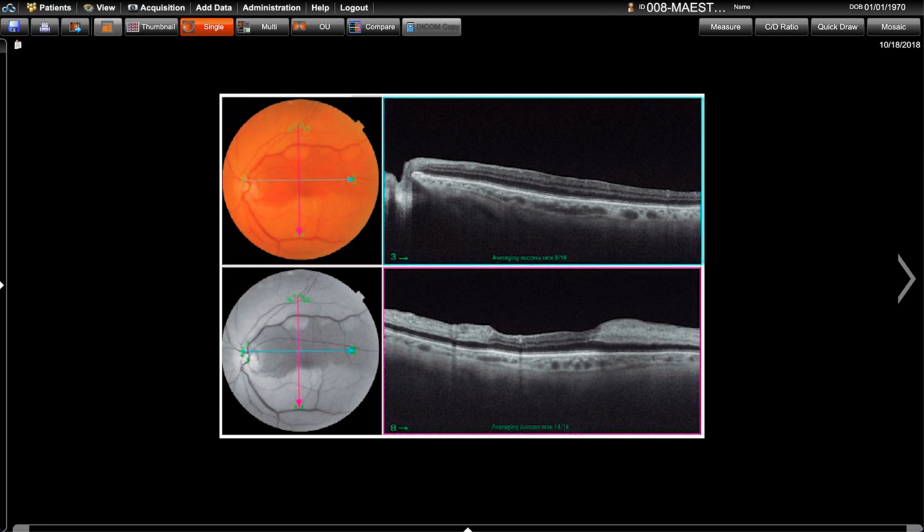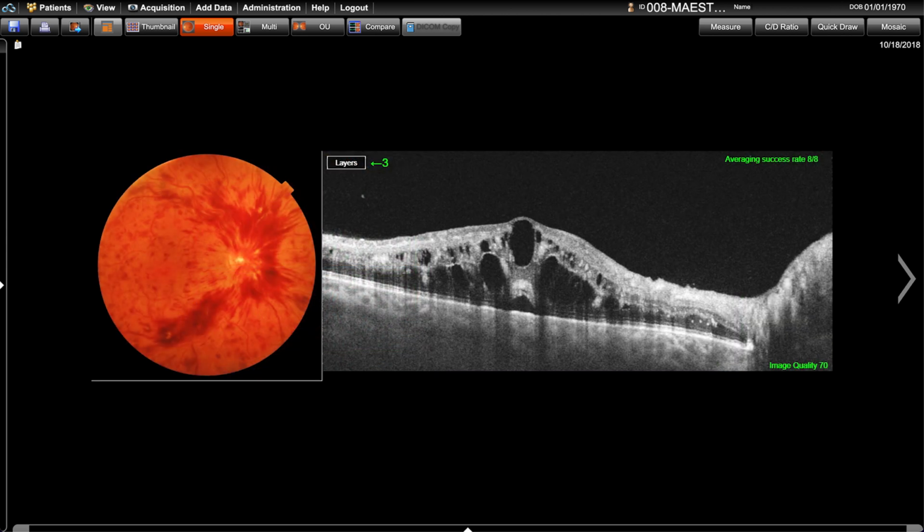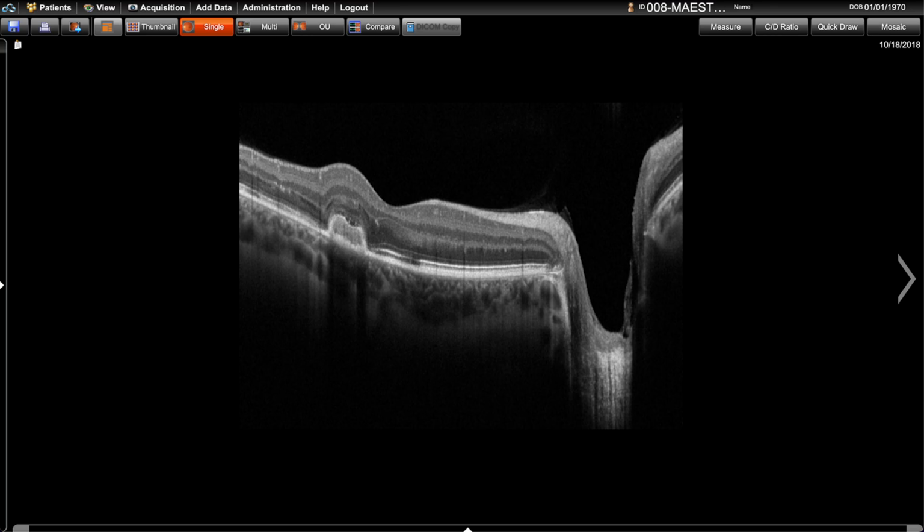What's interesting is that as we use this device more and more, we're able to identify a whole range of other diagnoses, whether it's diabetic macular edema, central retinal vein occlusion, or macular degeneration converted to the exudative form, all things that could potentially result in vision loss.